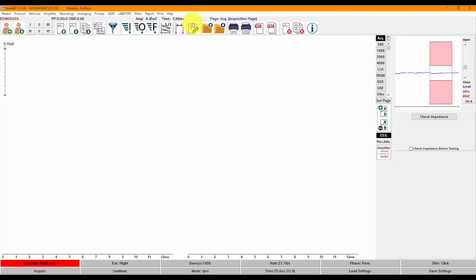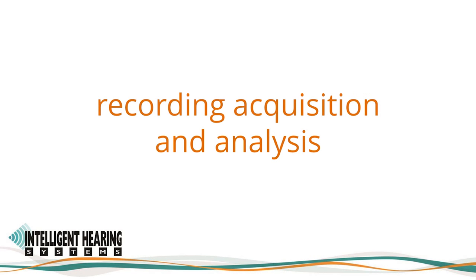Right below the menus, you will find a toolbar with various shortcut icons for easy access to often-used features. Shortcuts include: create and access patient records, label recordings, load and save recordings, apply filters, arrange recordings, save and print recordings, add notes, and access the user's manual.